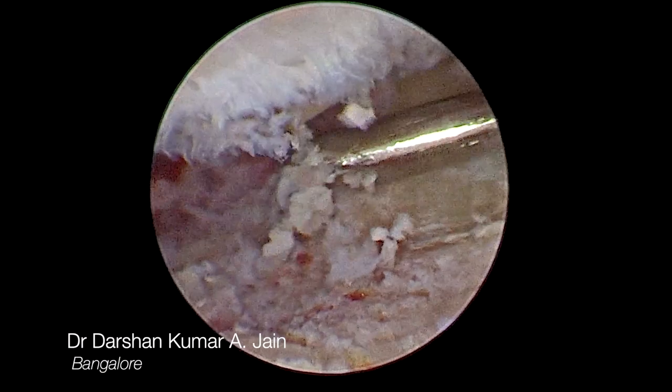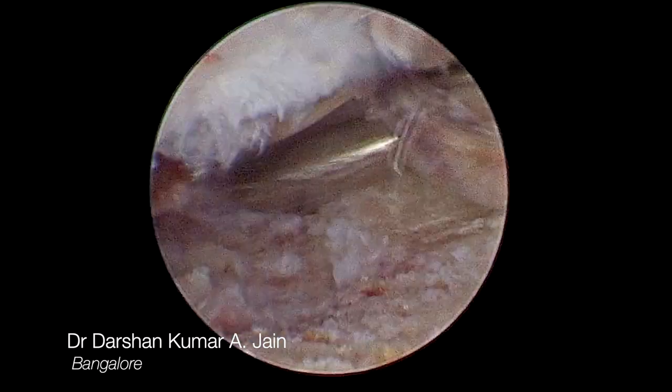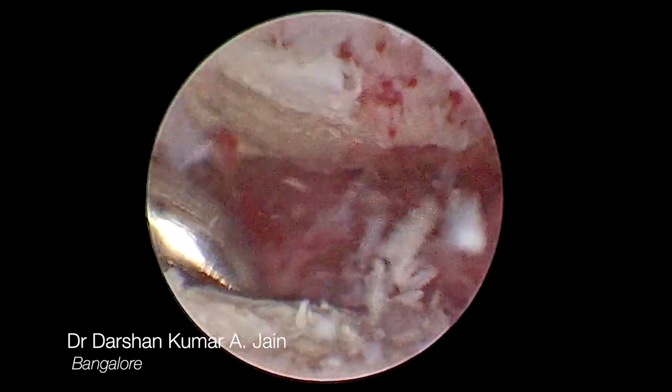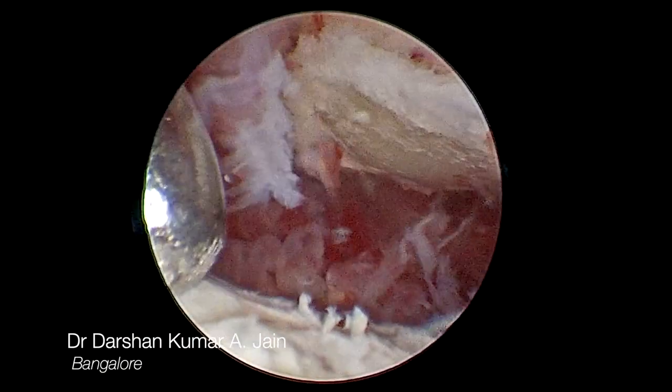In the second stage, done two weeks after the initial procedure, the radiocarpal joint was debrided and the residual articular cartilage was curetted. A burr was also used to freshen the surface of both the radius and the carpus.